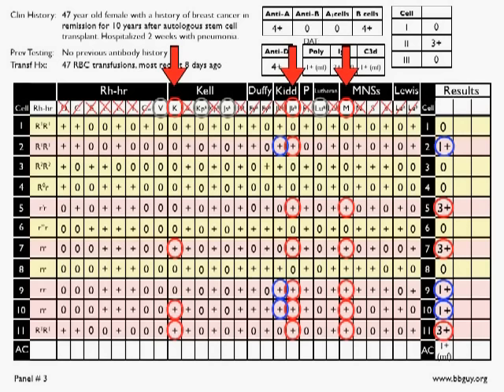And in addition, the reality is that the vast majority of anti-M antibodies, you really shouldn't see them reacting in gel because they are typically IgM, room temperature reactive antibodies that are generally clinically insignificant. So they don't come through, but on occasion they do. Believe me, I've dealt with enough of these that anyone who's ever worked with gel will tell you, yeah, you definitely see examples of IgM that come through. So while I think it's safe to say that anti-JKB is the most likely antibody in this particular example, anti-JKB alone, you would definitely have some work to do to rule out the M, rule out the big K.